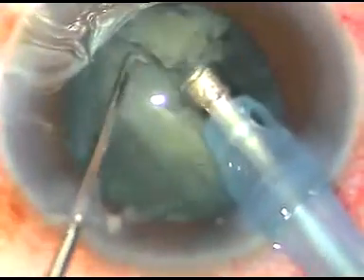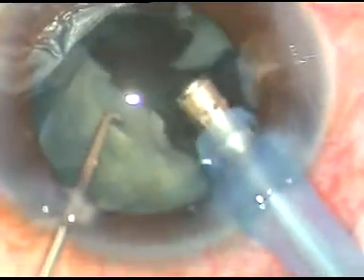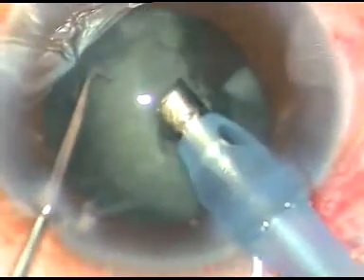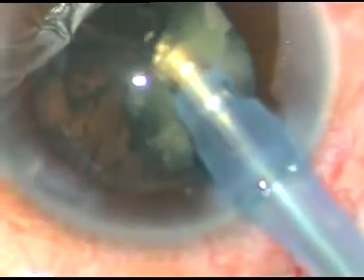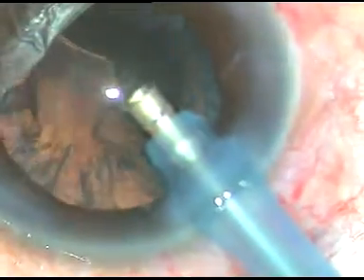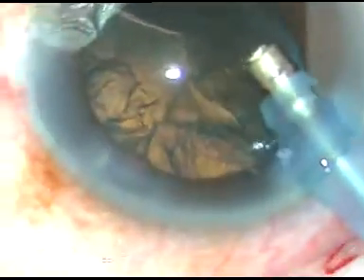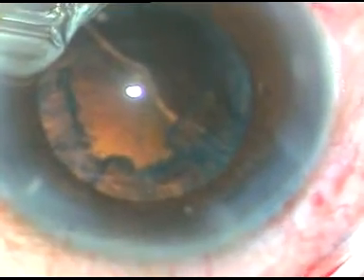See, this nuclear fragment which has gone underneath the iris is not coming now — we have to keep a trace on that. The nuclear fragment is there at 9 o'clock underneath the iris. The chopper has been removed, the posterior capsule has gone behind, and that's it. The fragment which was there also came out.